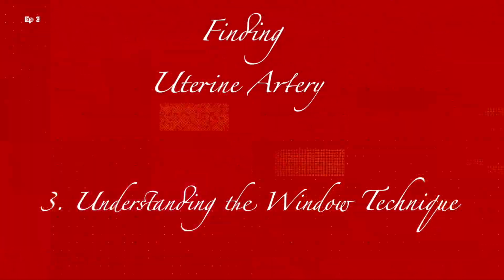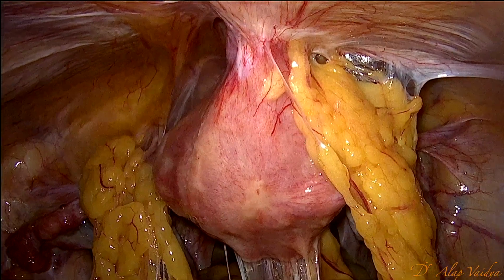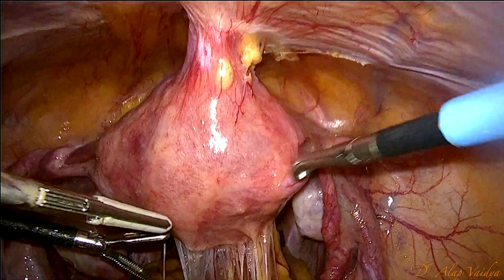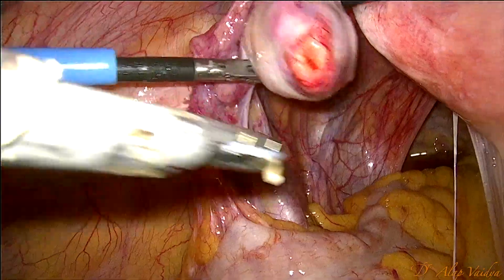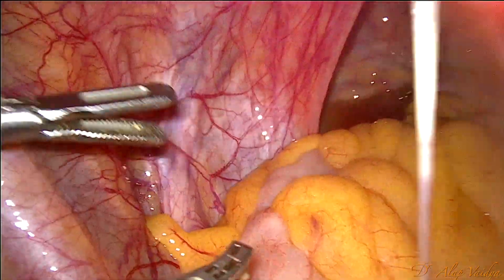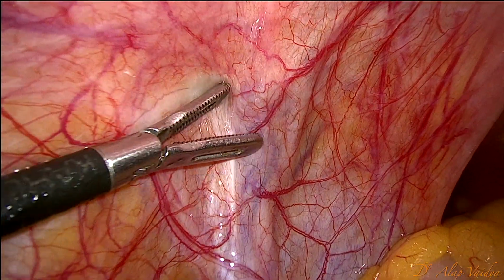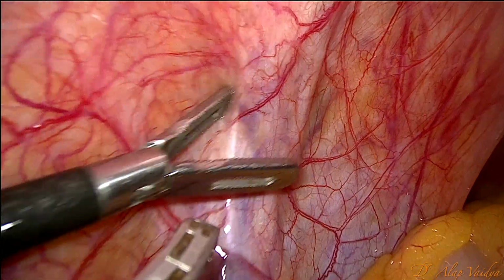Welcome back, friends. This is a case of ventrofixed uterus, and after doing some omental adhesiolysis, because we have to preserve the ovaries and the round ligament, we are going for the window technique. We trace the ureter and look for the impression of the uterine artery.